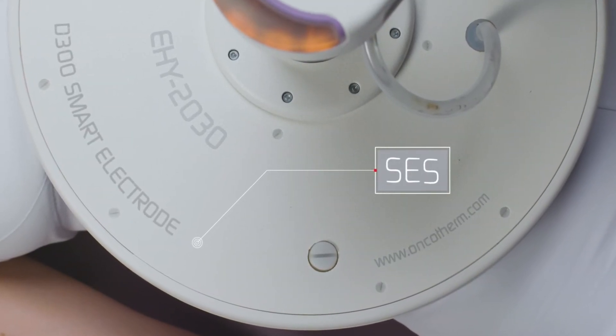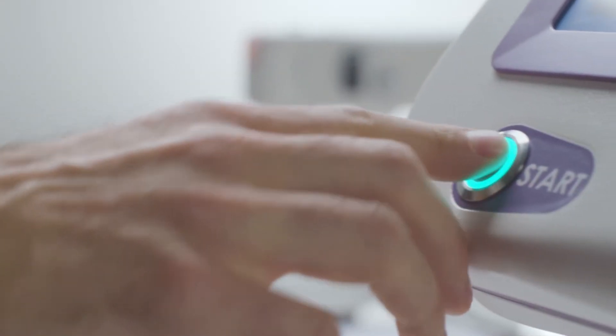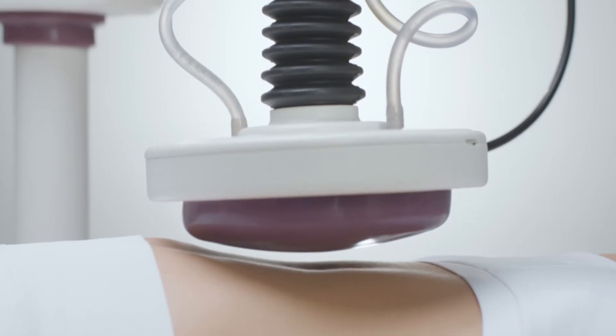The smart electrode system provides visual feedback to physicians and adjusts perfectly to ensure the right fit for each patient.